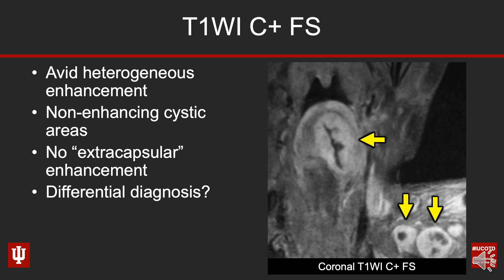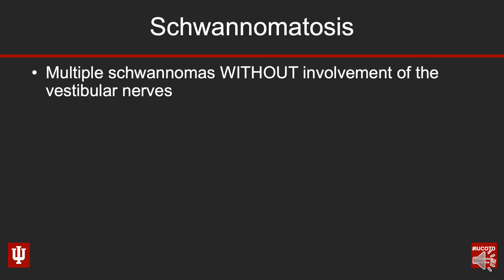So what's your differential diagnosis? We have a mass that is circumscribed, a bit heterogeneous in signal intensity and attenuation, possibly with internal cystic areas, located in the supraglottic larynx — but we have similar-appearing masses in the carotid space at the level of the nasopharynx, and in the supraclavicular and infraclavicular fossa on the left, right along where we'd expect the brachial plexus and branches of nerves in the neck.